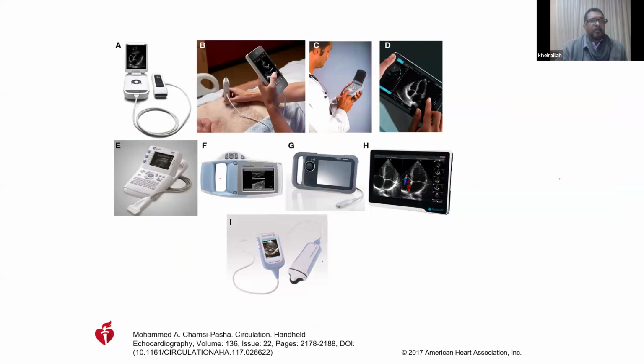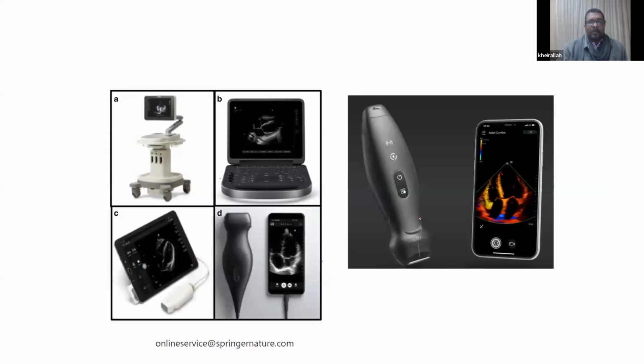And also the echo has changed in size. It becomes portable. Now we have mobile-based echoes. The laptop or the tablets is now everywhere. But even now it has moved to the mobile. So there is a software you download in the mobile and you just have the probe which you connect. There are even probes that work with Bluetooth with the mobile. So you can see the images in your mobile.